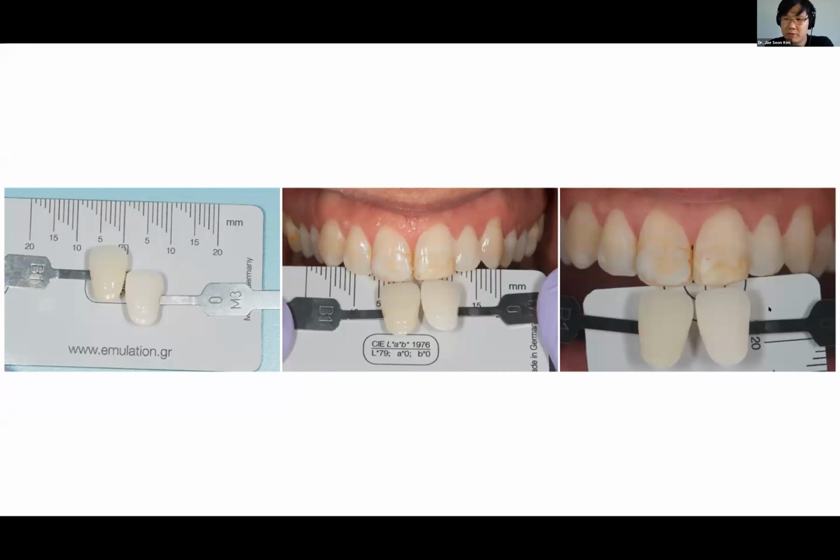But one of the problems I found with these cards is that it's too big. If you try to put a card upright in the patient's mouth, unless the patient is very class 2 or can open really wide, the card just doesn't fit in, and you can't take it at a perpendicular angle. So I just turned it sideways so it fits in there, and then I try to line up the shade guide as best as possible, try to keep it apart, and then you take photos of this and the shade guide, and you send it off to the lab.